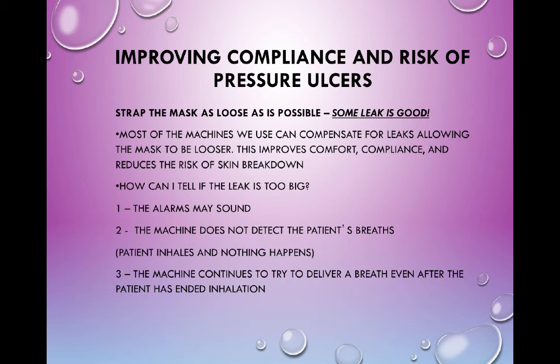If you look, a lot of them have like a lip that moves. So when you strap it loose, the lip kind of comes out and seals against the face. So if you strap it tight, you're basically eliminating that. So we do want leaks. That's going to improve compliance. It's going to reduce the breakdown of the skin.